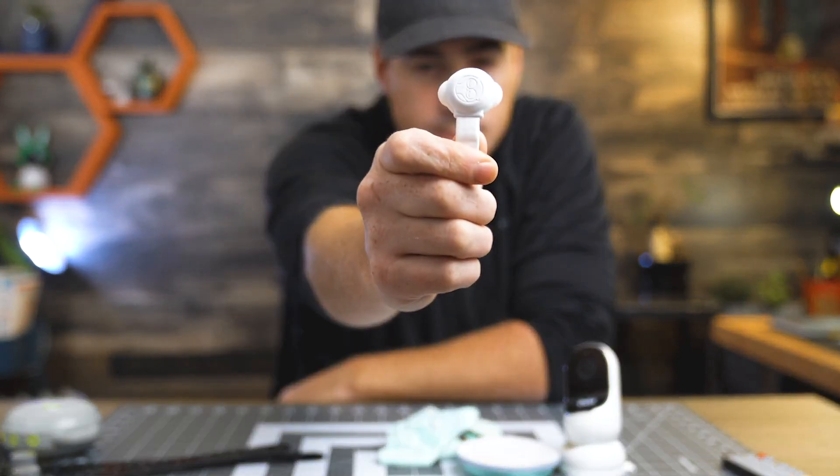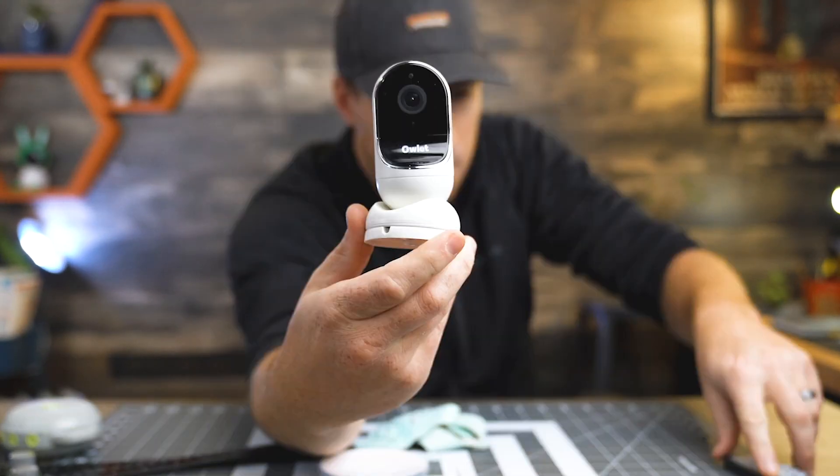The Owlette Sock, the Owlette Sensor, the Owlette Base Station, the Owlette Camera. Do you need all of this to accurately monitor your baby's breathing? Or can baby monitors like the Cocoon Cam or Miku Baby Monitor provide what you need without all of the extras?